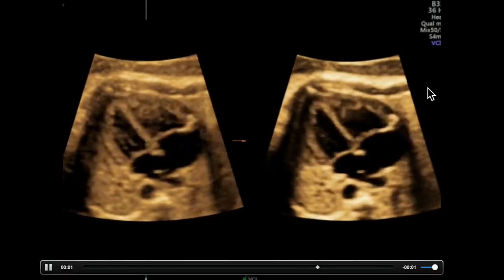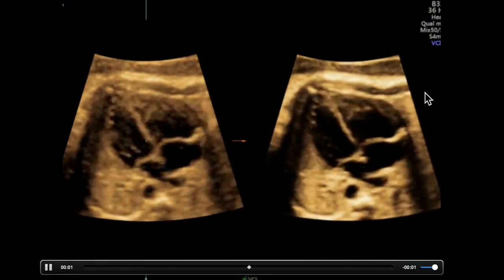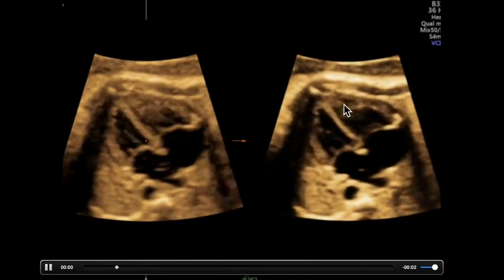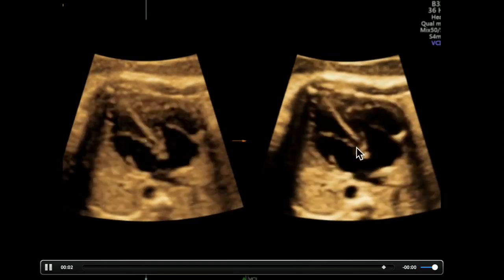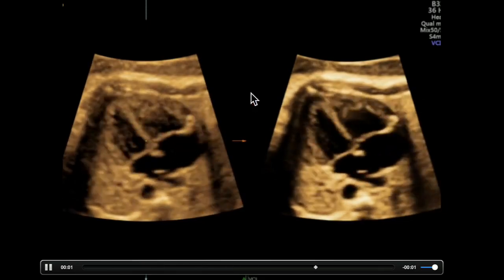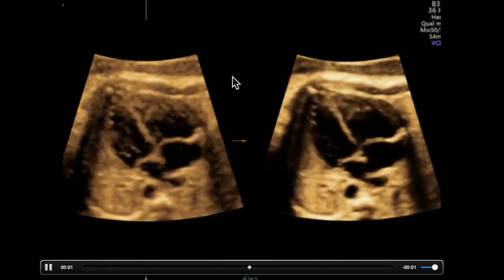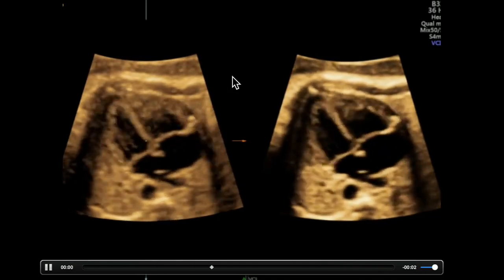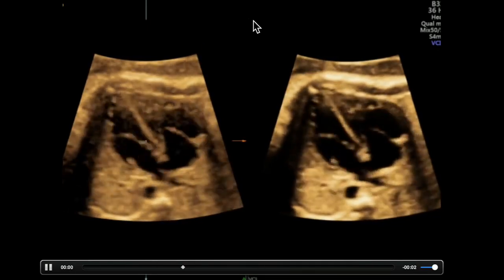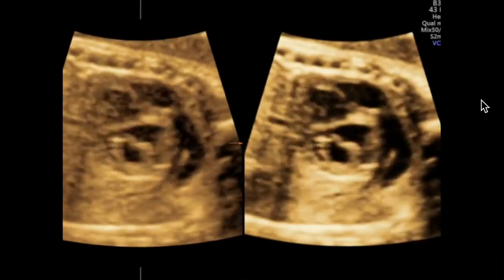Here's some side-by-side examples of really small slice thicknesses to show the delineation of the contrast, valve motion, myocardial movement, et cetera, superior to the 2D image. Now, you don't have to do these side by side. You can image VCI-A as just a single screen, but most of these are done as side-by-side imaging just to provide some contrast for you.